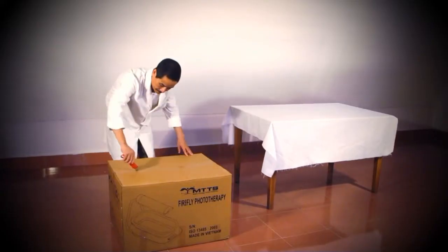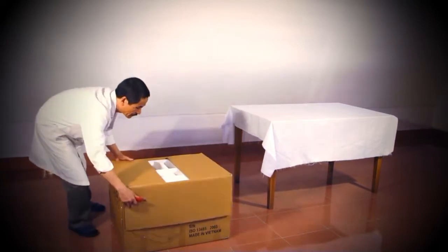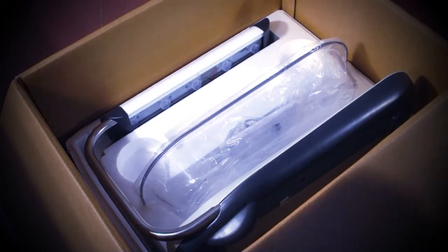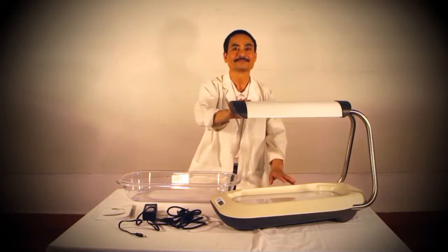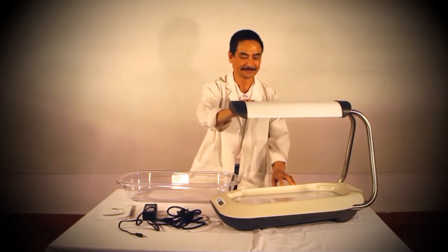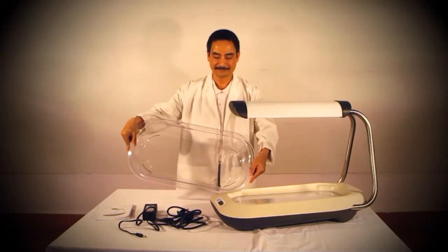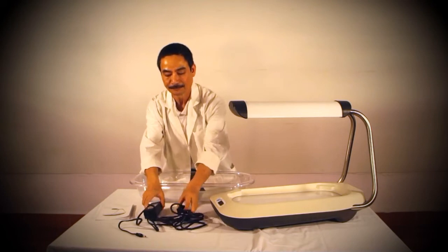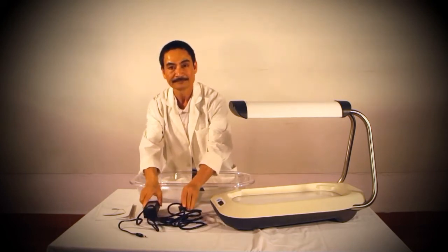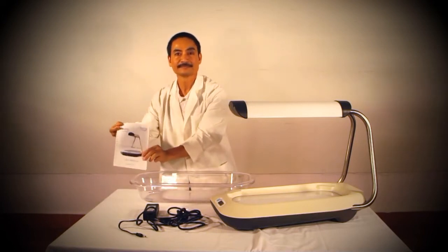To begin, open the box. Inside the box you will find everything you need to install the Firefly. The pieces include the main unit, the bassinet, two pieces of the power cord — which is the AC cord and the power supply box — and a user manual.